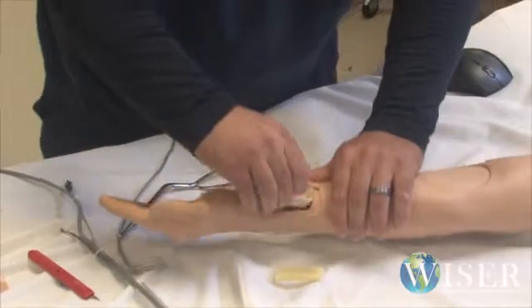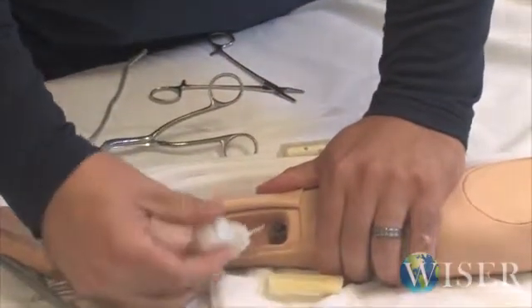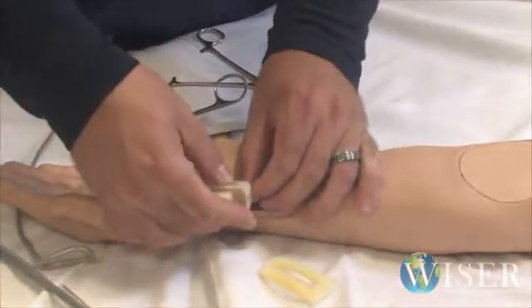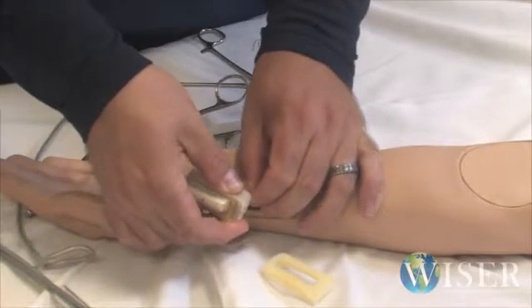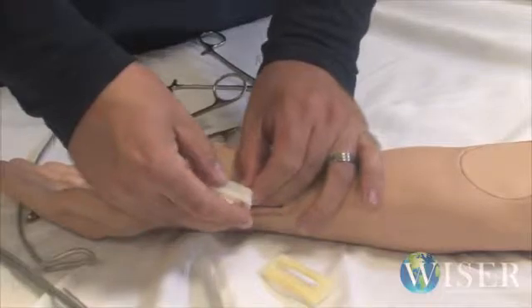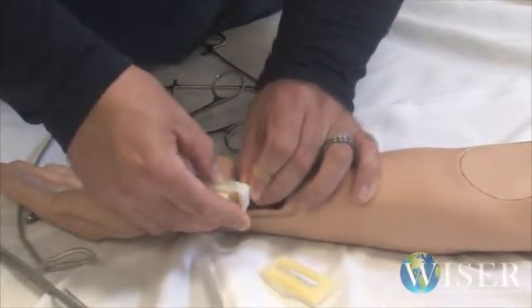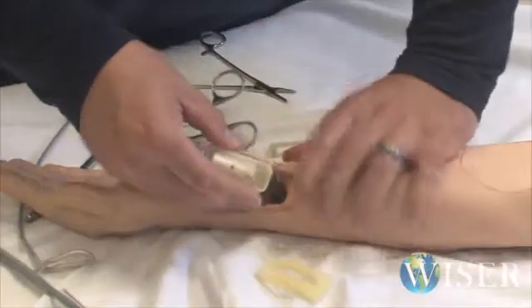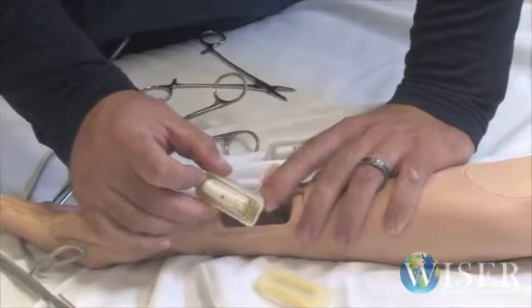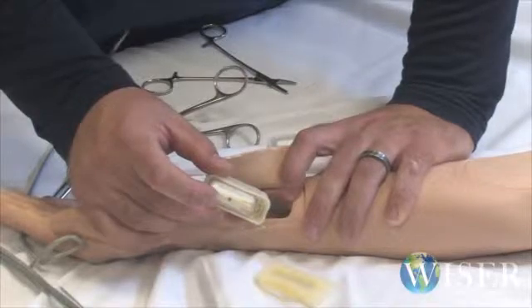You can see that this one is connected. And that's the connection you want to see. Make sure that's secure. You can even reseat that just to make sure your connection is secure. But 9 times out of 10, that's usually what the issue is with these modules. They become unfastened and that's your issue. You reconnect and your pulse is back.